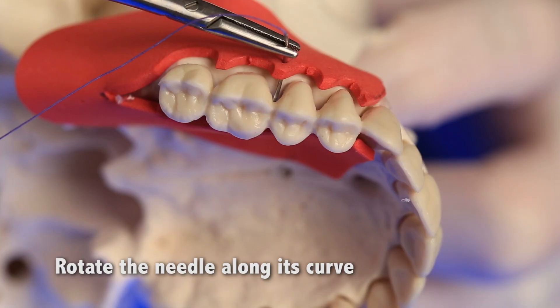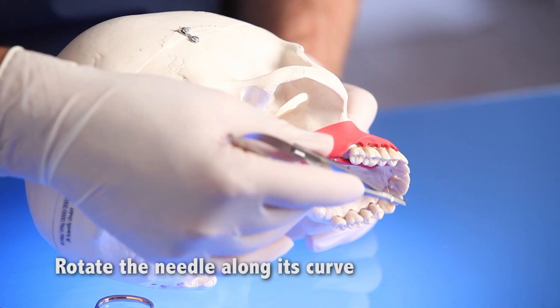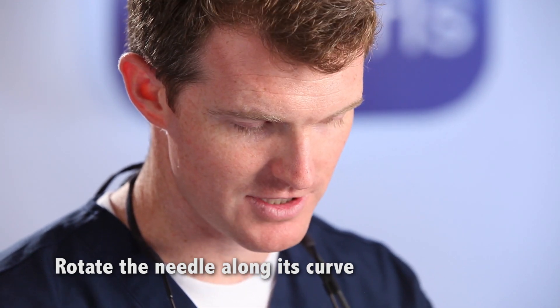Number two, rotate the needle through the tissue instead of pushing it through the tissue. If the needle passes along the curve, it creates a small puncture. If you push it, the outside part of the needle will create a cut as it passes through the tissue.